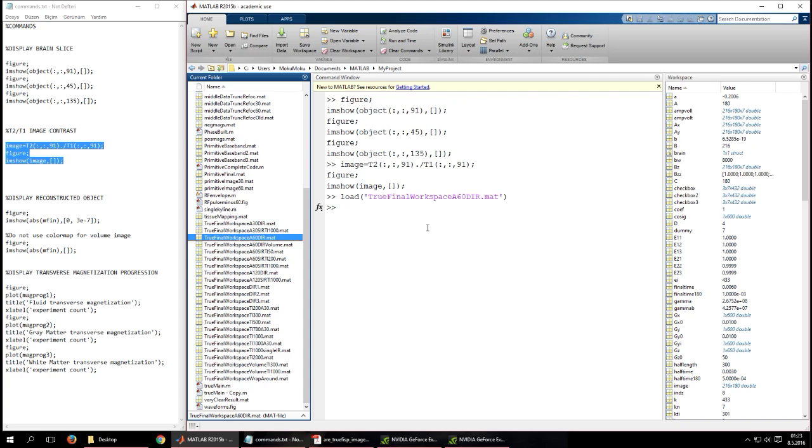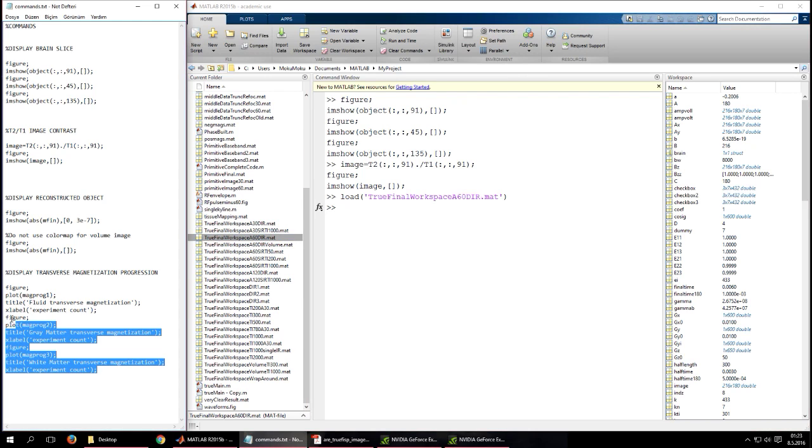So the first 6 simulation results I will display are results for when only the contribution of the z equals 91 plane to the signal is considered and other planes are ignored. First, I will show a simulation in which plus minus 60-degree pulses are used and the magnetizations are prepared with double inversion recovery, where Ti1 is set to 0.8 seconds and Ti2 is set to 0.44 seconds.